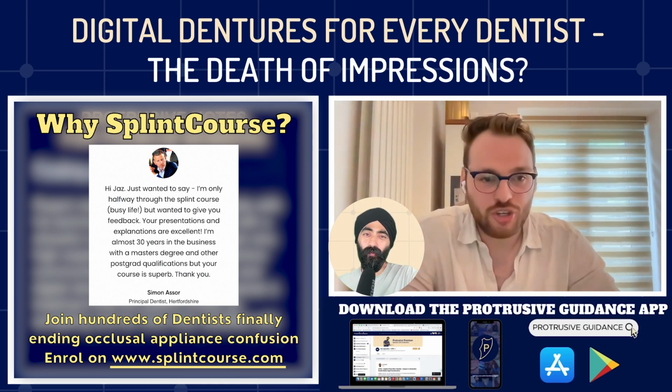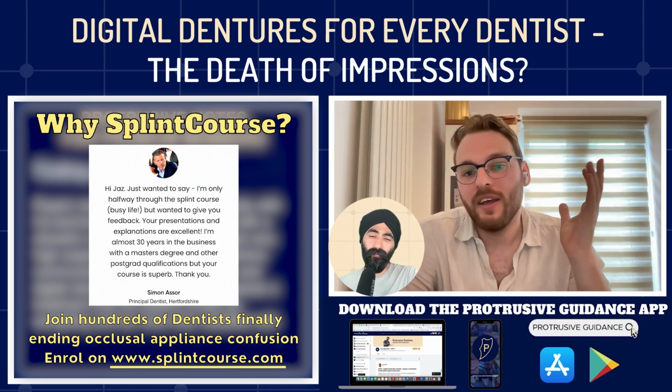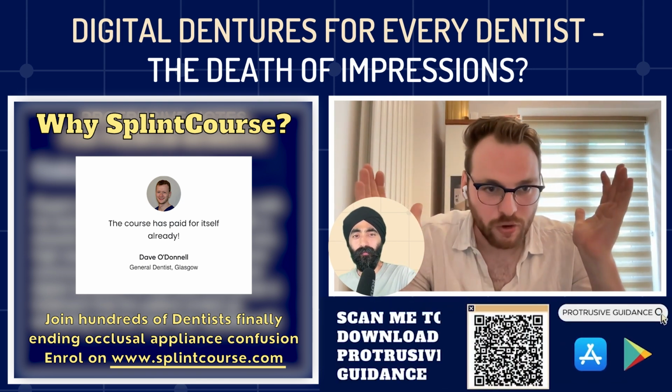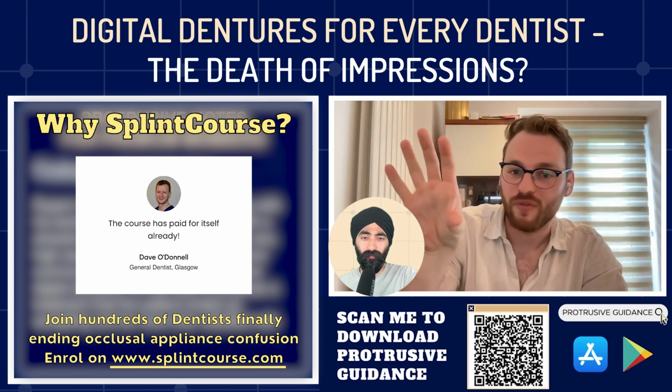But in the consultation, I relined a denture with silicone and scanned it. Dean made a quick mock-up at the next appointment. And I said, we can give you this. I'm going to charge you for it, but this is going to gauge both of our expectations. This is 90% of what we can achieve.